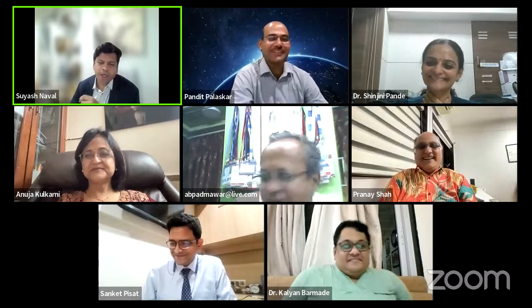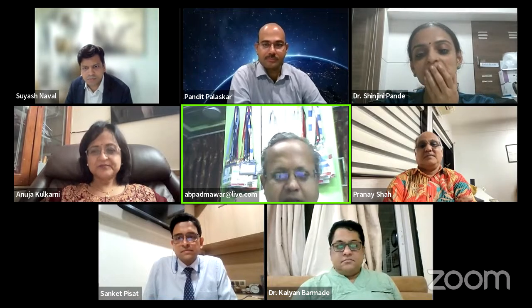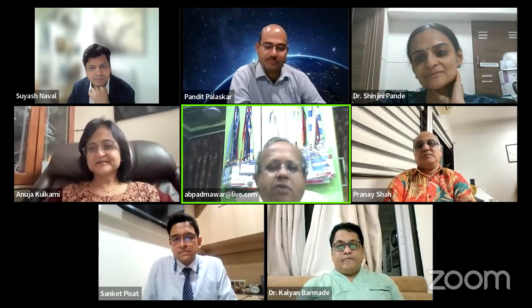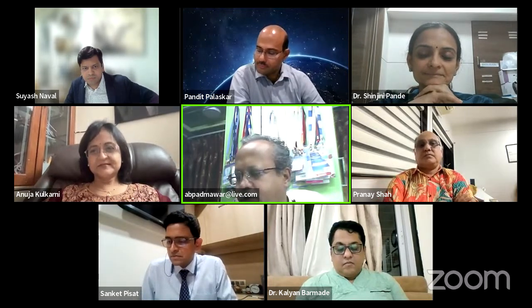Yeah, thank you. Amay sir, I wanted to ask this question. Pranay sir mentioned that in the laser plume, viral DNA and the papilloma virus have been identified. What about the fumes created by cautery and harmonic? Can they even have viral particles, or can a virus be detected? In fact, the particles formed with the use of ultrasonic energy are larger particles, so they can be good vehicles for transmission of biological agents, bacteria. That is why during the COVID-19 era, we started using the smoke evacuator. Exactly. So that is what we were coming to, that the use of smoke evacuation systems with all these advanced energy sources is an essential part of the armamentarium for all surgeries.